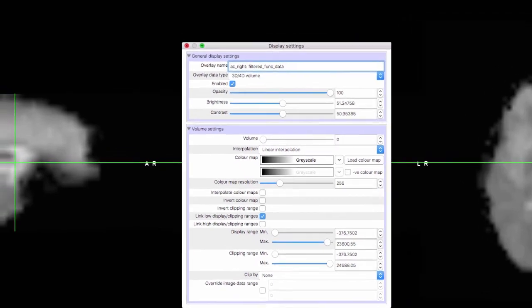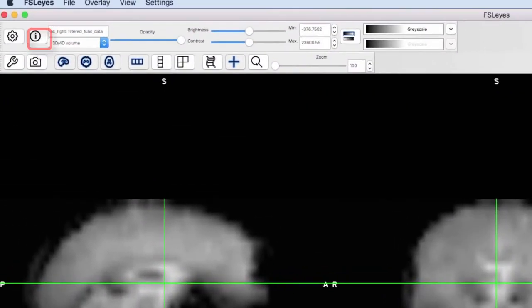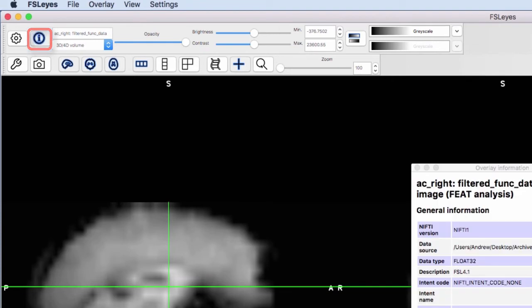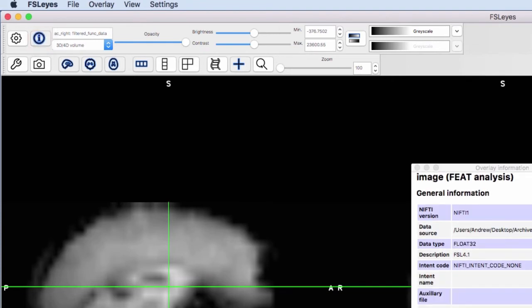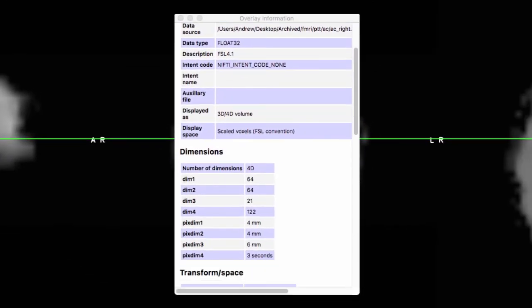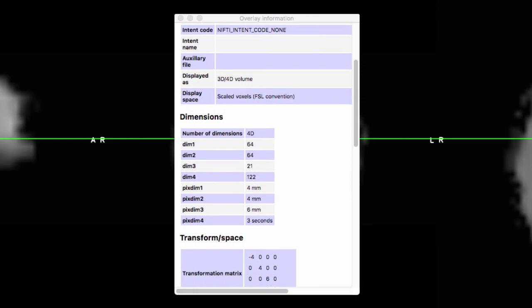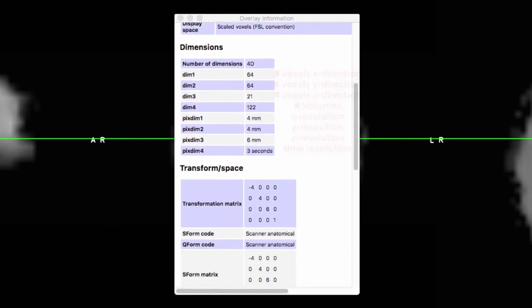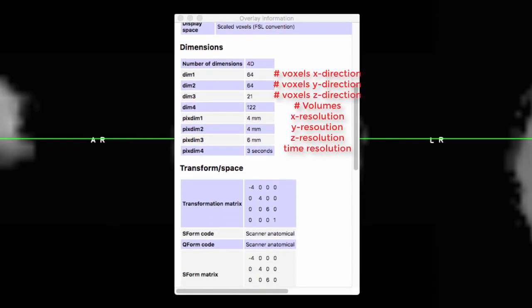To see the dimension, transform, and orientation information, click on the Information button. For example, you can see the number of voxels in the X, Y, and Z directions, as well as the number of volumes and voxel resolution.